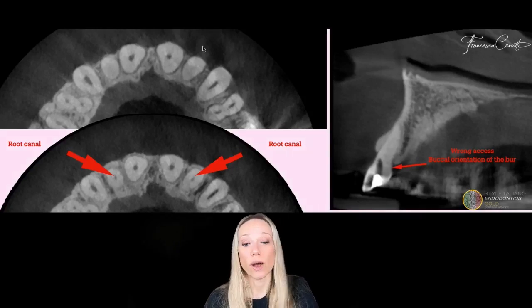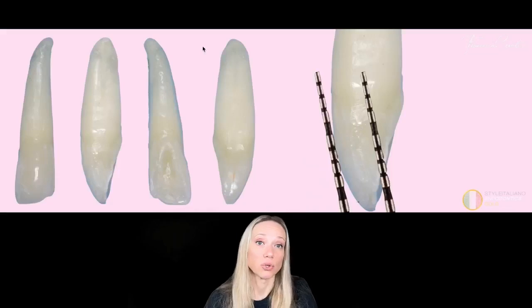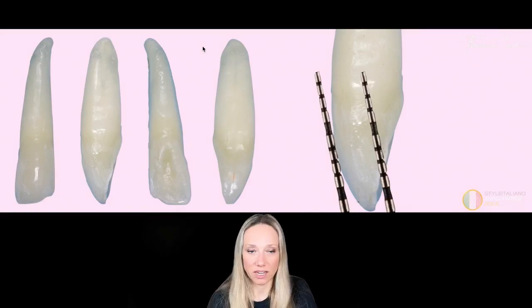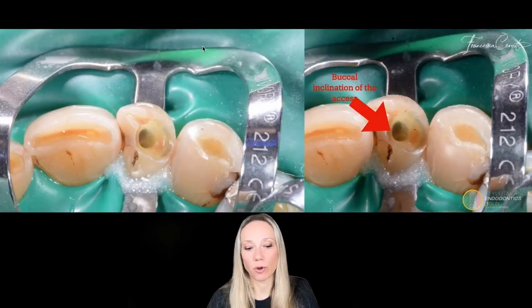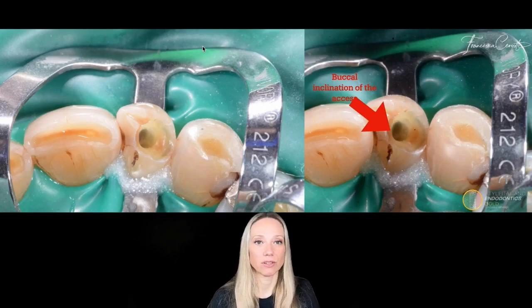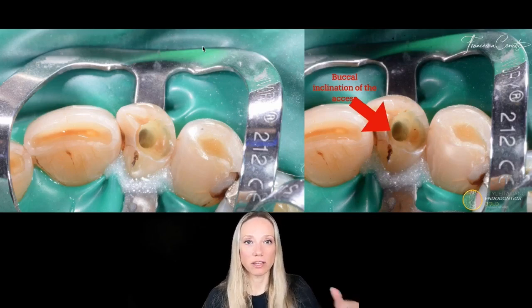And so one good thing that you could do when you have to treat incisors is to remember the inclination of the crown of the incisor and not to lose your reference point. You can do, as I did in this case, a multiple isolation. In this case, you will always have the nearby teeth in your sight, and so you will always be able to check if the inclination of your bur is correct or not.